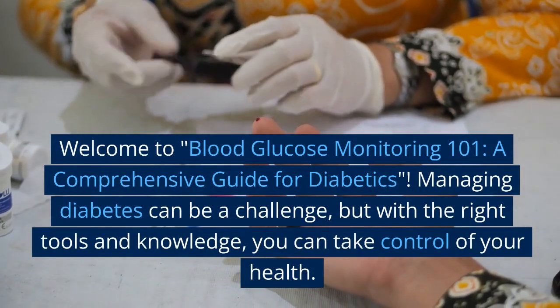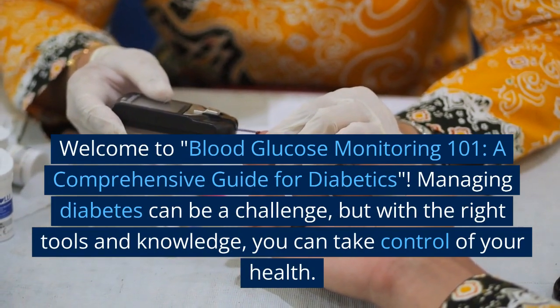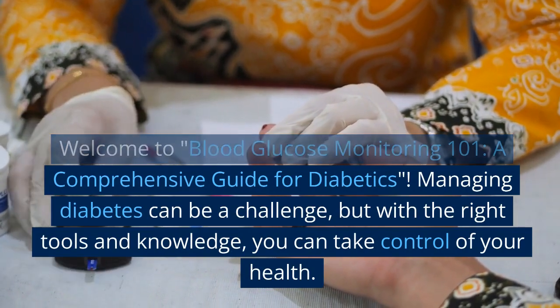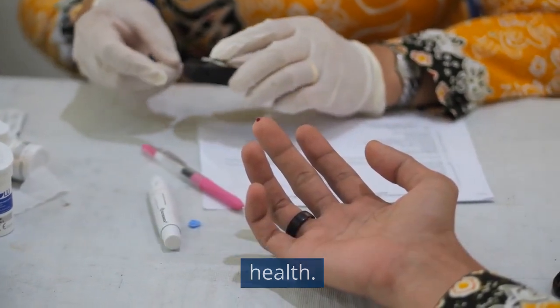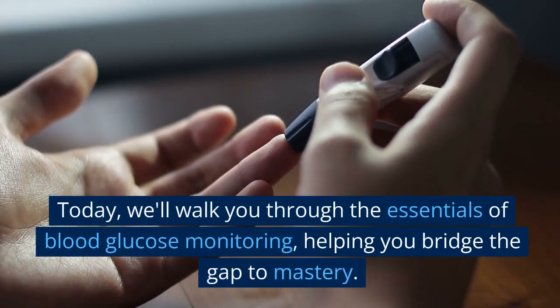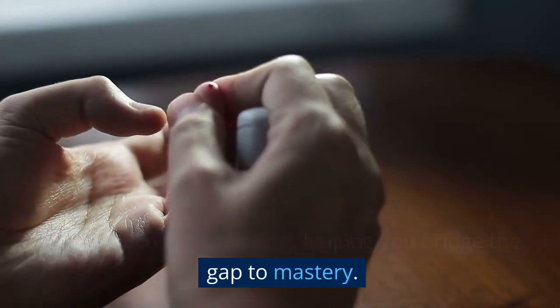Welcome to Blood Glucose Monitoring 101, a comprehensive guide for diabetics. Managing diabetes can be a challenge, but with the right tools and knowledge, you can take control of your health. Today, we'll walk you through the essentials of blood glucose monitoring, helping you bridge the gap to mastery.